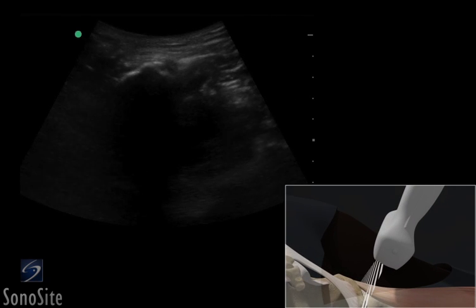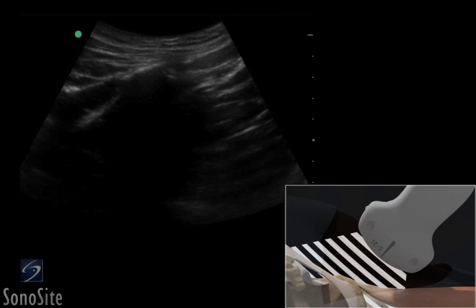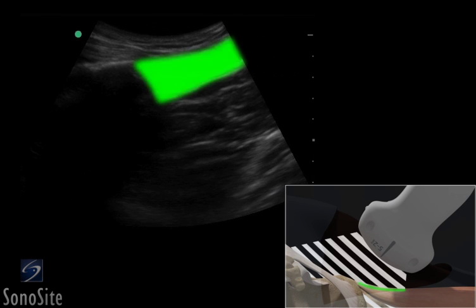The transducer is then rotated 90 degrees clockwise with the orientation marker directed at the patient's head to obtain a long-axis view of the hamstring muscle.